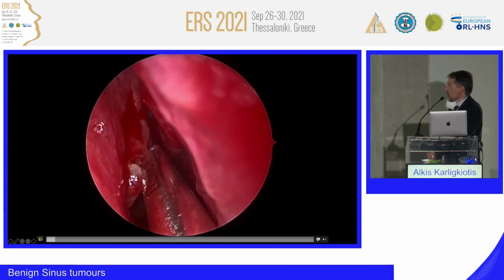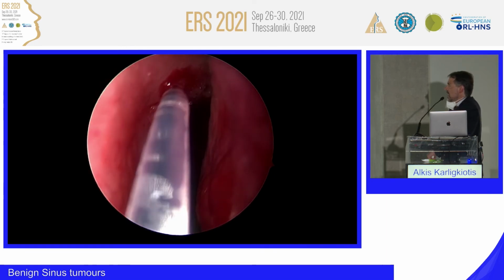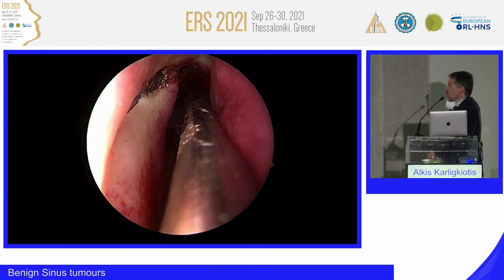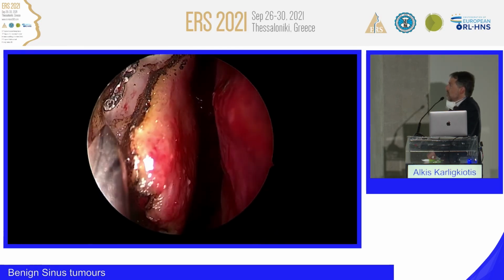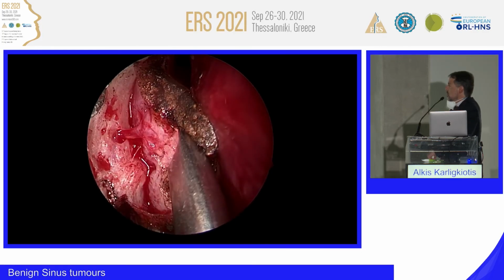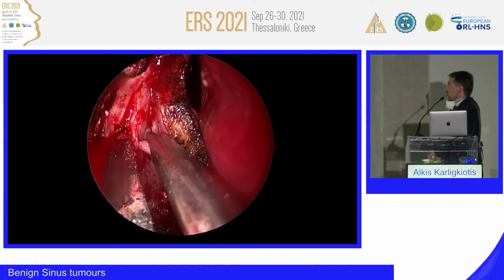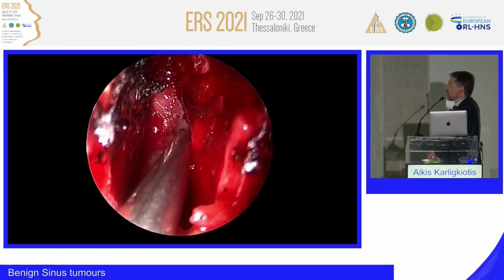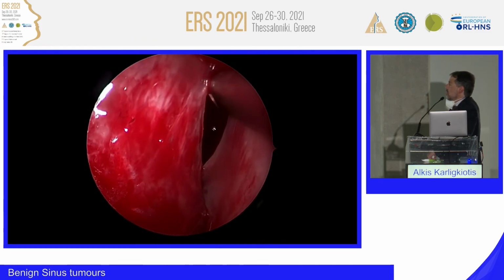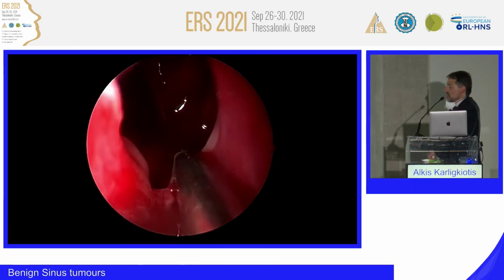Nowadays we always start with the prelacrimal approach if we feel that the medial wall is not involved by the tumor, and even if we think that it may be involved, we try it the same. We make an anterior incision in front of the head of the inferior turbinate, release the inferior turbinate mucosa, and then do the anterior osteotomy anterior to the lacrimal duct. Then we fracture the medial wall, this is the mucosa of the medial wall of the maxillary sinus, and we enter the maxillary sinus.